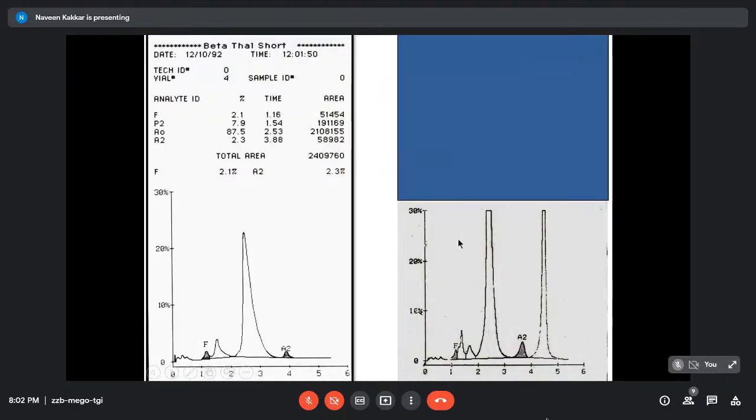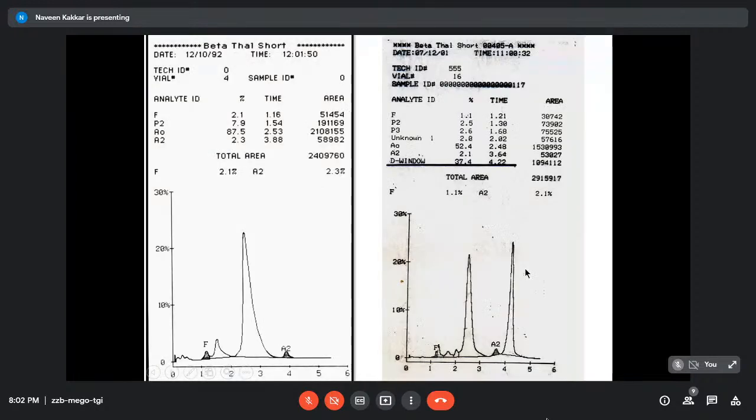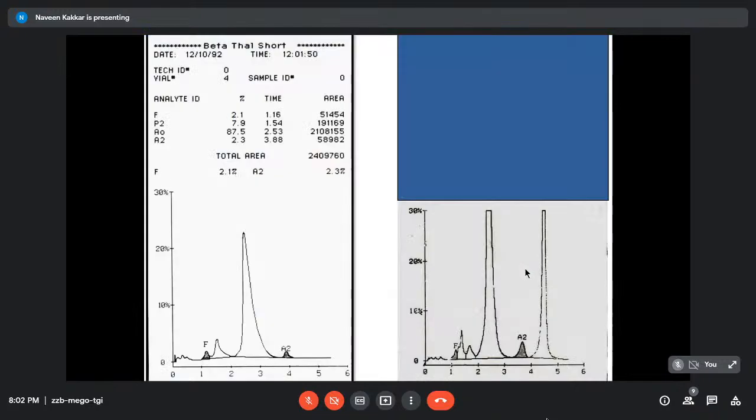Again, compared to normal, looks like the last one. If you go back to this last one, looks similar, right? So again, there's a new peak beyond A2, but this seems slightly further up. So if I again drop from the mid and try to see what the retention time is likely, it's close to 4.5 something, midway. The earlier one was somewhere here. So this slight difference is important. It's important in electrophoresis, it's important in HPLC also.